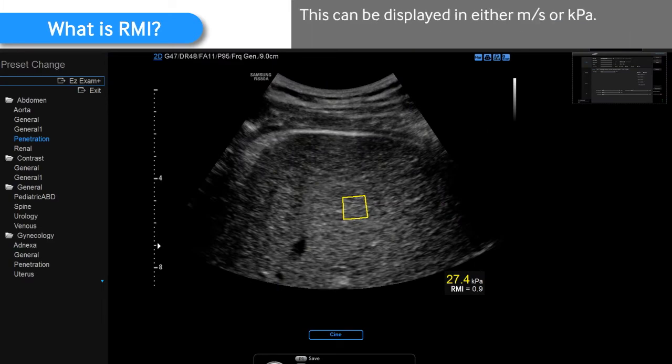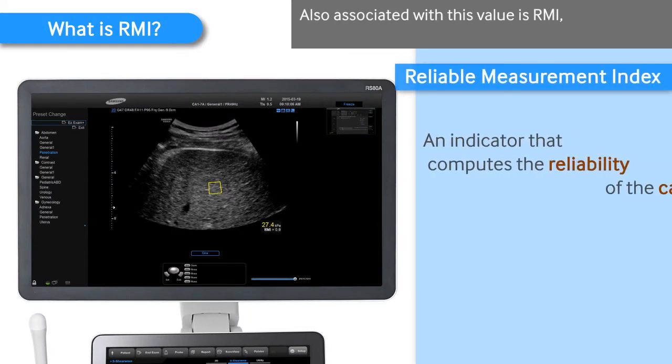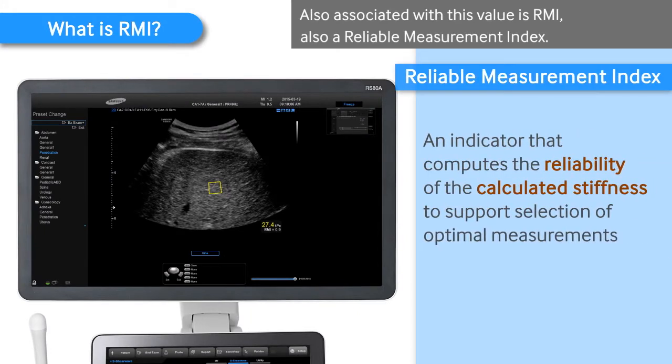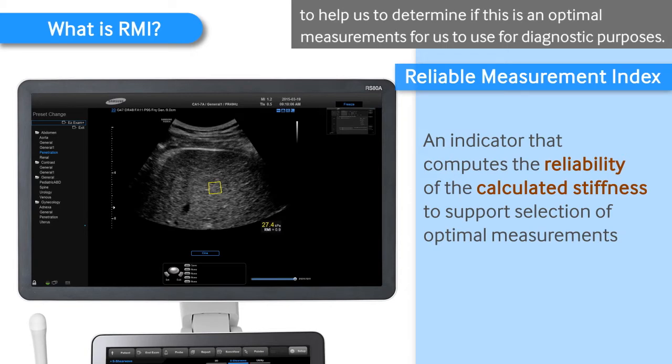This can display in either meters per second or kilopascals. Also associated with this value will be an RI, or reliability index. This is an exclusive Samsung technique to help us determine if this is an optimal measurement to use for diagnostic purposes.